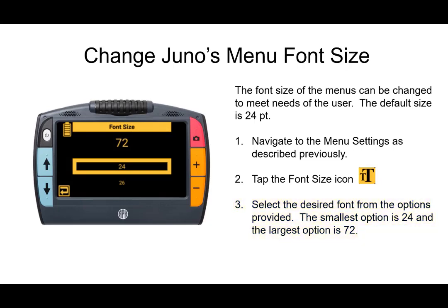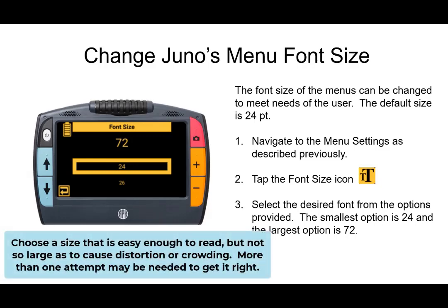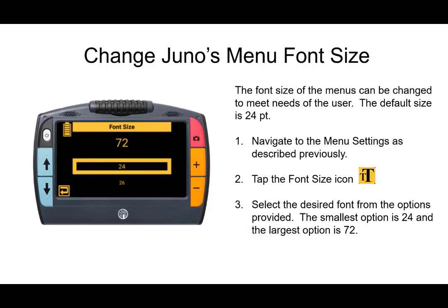One thing that the user manual does not state is that the larger the font is, the more possible it is to distort the way the menus appear and make them more challenging to view. So it's probably best to go for the smallest font that the user can deal with and be comfortable with. Bigger is not always better, and we sometimes make the error of going too large, and that can create its own set of problems. So experiment with the sizes and see what works.